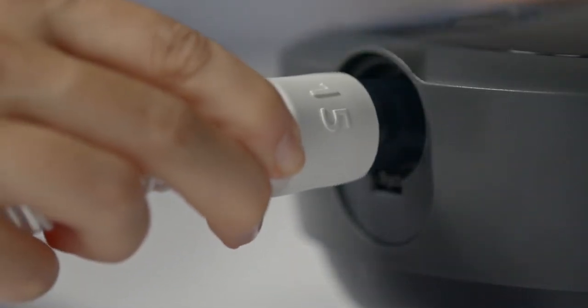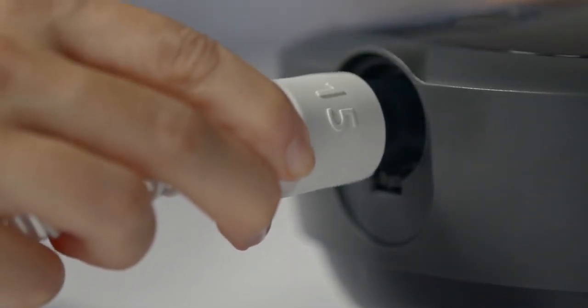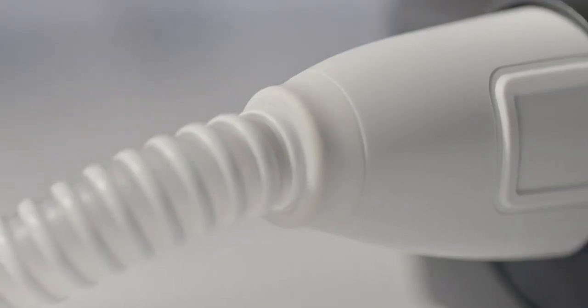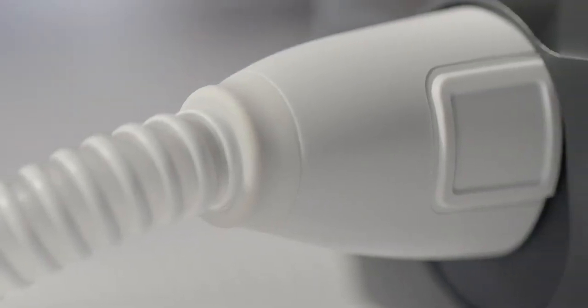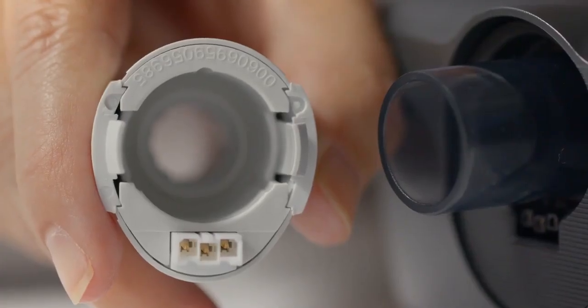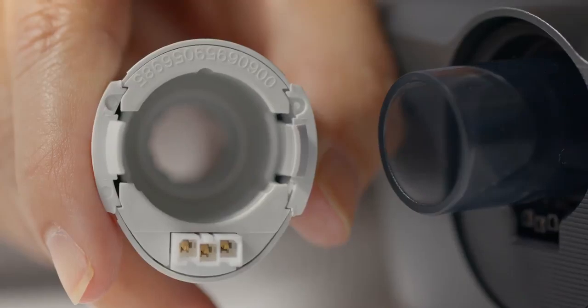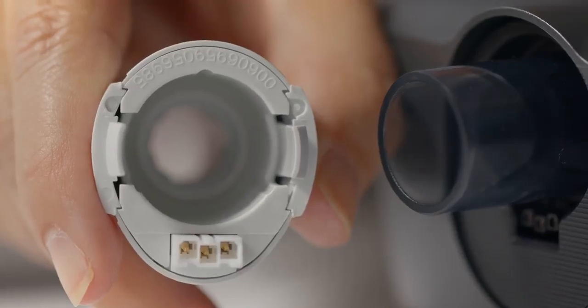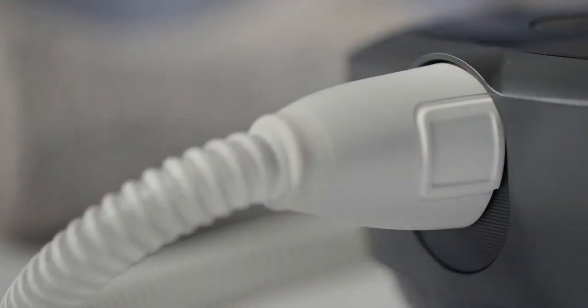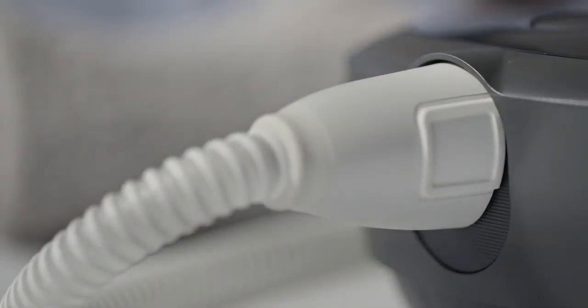Slide the end of the flexible tubing over the air outlet port. If you're using heated tubing, line up the connector on the heated tube with the pin connection on the bottom of the air outlet port. Press the heated tubing into place until you hear a click.